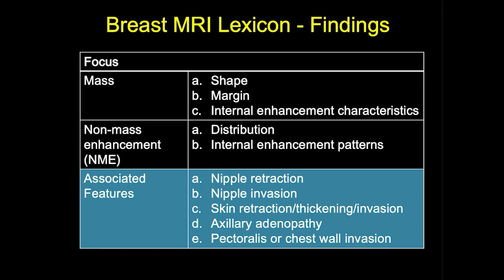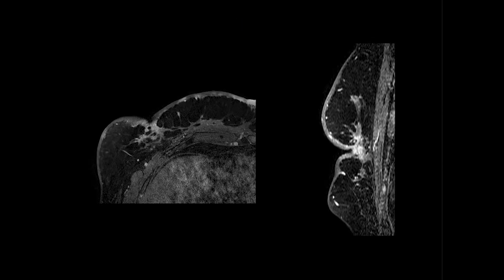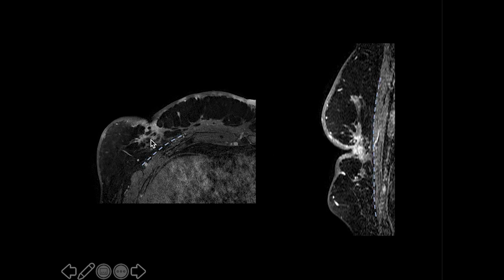Associated features important to note on breast MRI include nipple retraction, invasion, skin retraction or thickening, axillary adenopathy, and pectoralis or chest wall invasion. In a 71-year-old woman with IDC, there is evidence of nipple retraction on both axial and sagittal images. The mass approximates the pectoralis musculature; however, there is still a clear fat plane between the mass and the pectoralis muscle, and the pectoralis muscle itself is not enhancing.